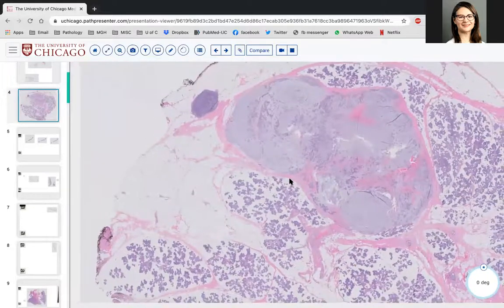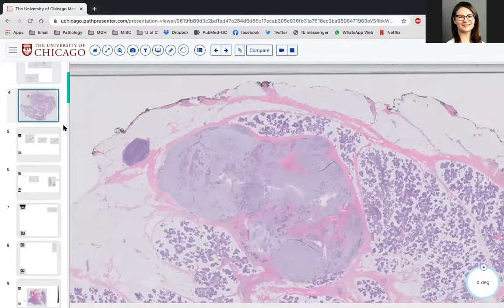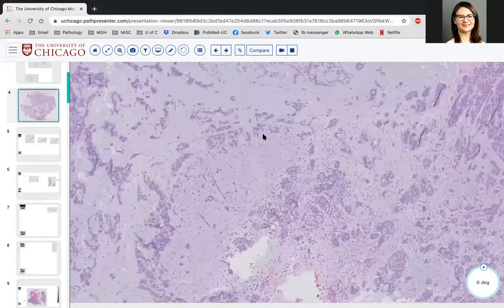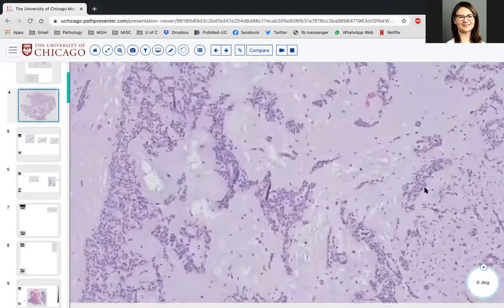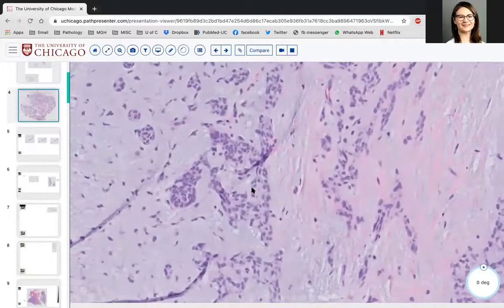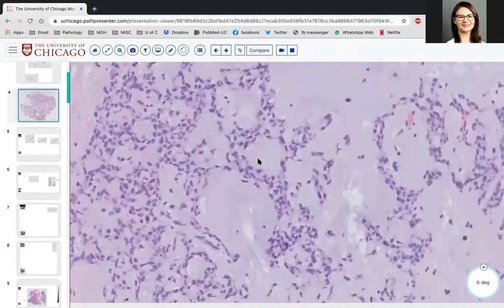And I believe this is exactly the same lesion that we saw on core. It's quite small, and it recapitulates the same features that we saw in the biopsy, right? Very myxoid, stromal rich, very bland epithelioid or spindled cells, like you said.